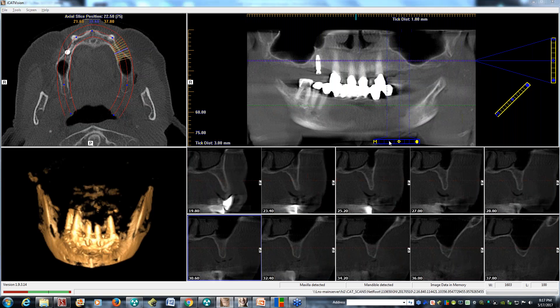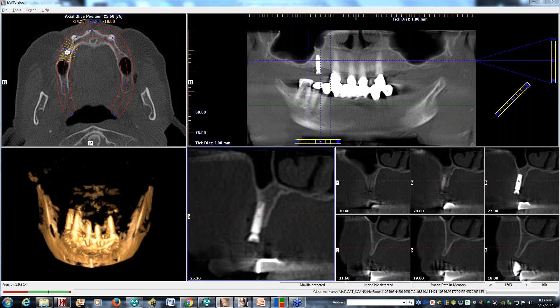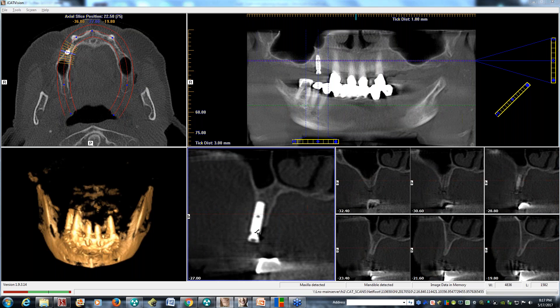Let's look at the CT. On the upper arch, we look at the position of the existing implant. I don't like that position if we're doing solid bite — I don't want an implant sticking out four to five millimeters from bone; that's in the way. I want to be able to do the alveolectomy where needed without obstruction. So that implant is coming out. I need a level ridge — if that post is sticking out, the prosthetic material in that area will be weak and risk cracking.